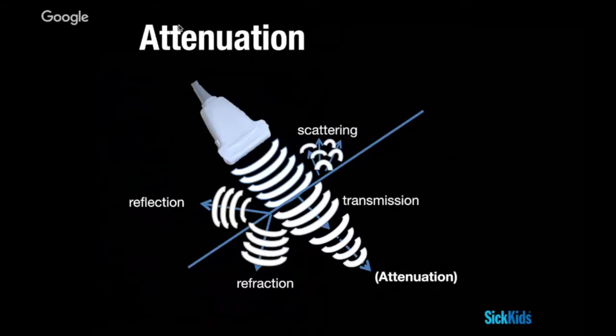And this is just a simple cartoon telling you about these ideas of reflection and attenuation. We talk about the qualities of the beam a lot, but what about the qualities of the tissue? Different tissues have different qualities in terms of, I let the beam through and I don't reflect, but I attenuate, suck out all of its energy and amplitude as it goes through. Or there are some substances that reflect, some that attenuate a lot, others that reflect, some that don't attenuate that much. So we'll sometimes talk about different tissues in terms of those qualities, the quality of the tissue itself.